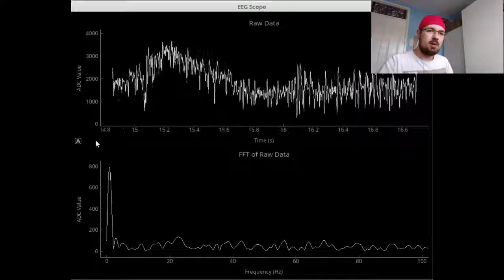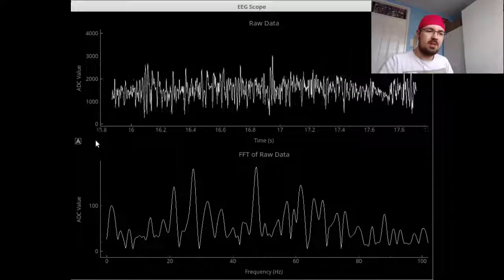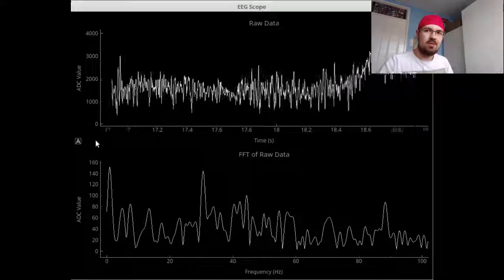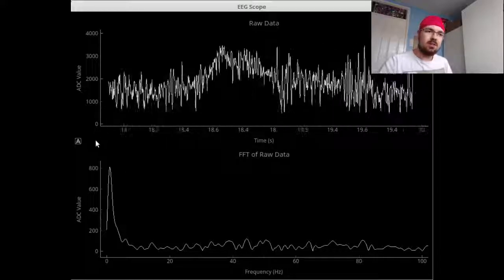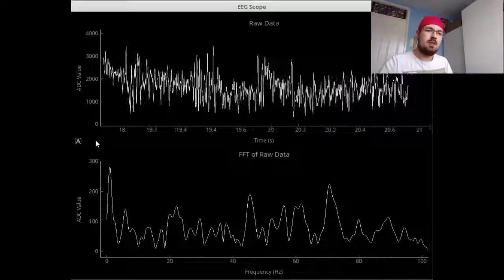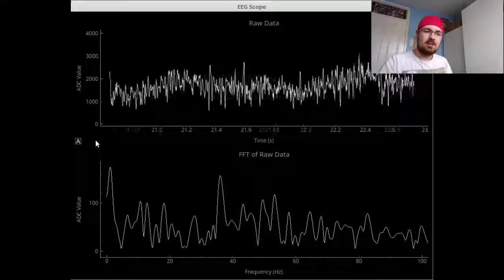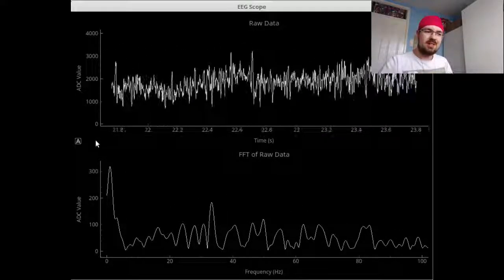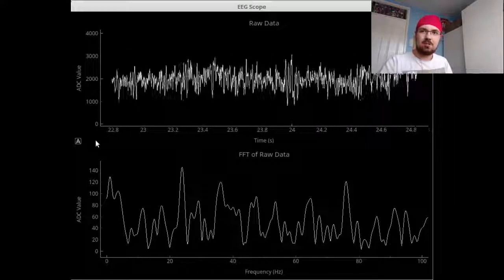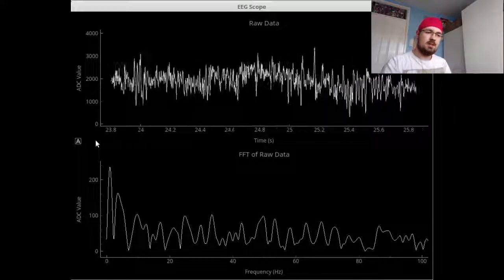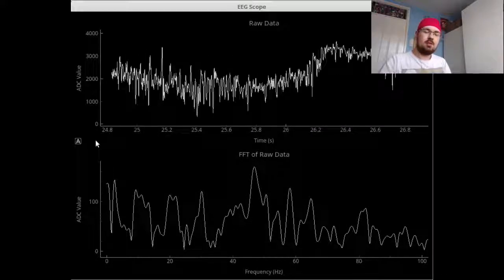On the bottom we see an FFT of every second of the real time trace. I'm going to close my eyes and hopefully you'll see the 10 hertz spike that we've seen before.